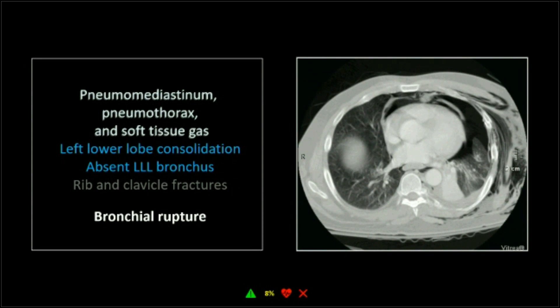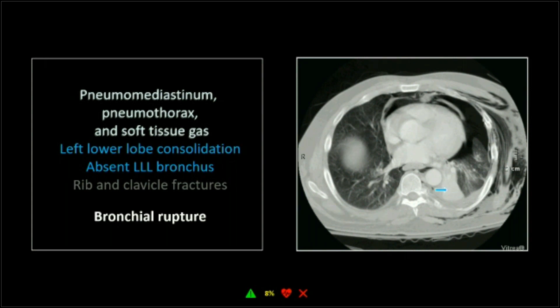A couple cases of bronchial rupture. This one is the classic — you can see there is pneumomediastinum, there's a pneumothorax, there's extensive soft tissue gas, extra-thoracic soft tissue gas. And then there is complete collapse of the left lower lobe. You don't see any air bronchograms in that left lower lobe, and it's very completely atelectatic. This is the classic appearance of these.